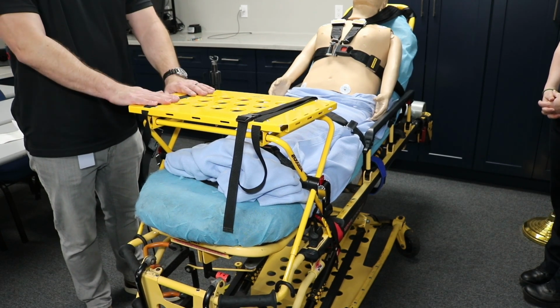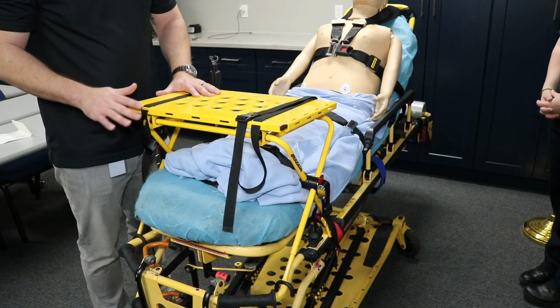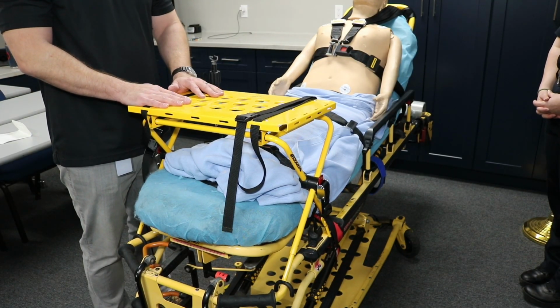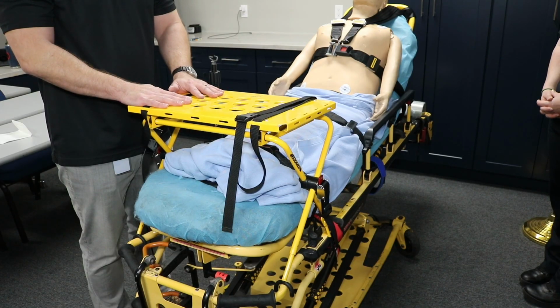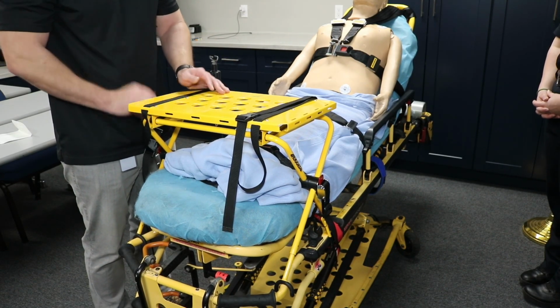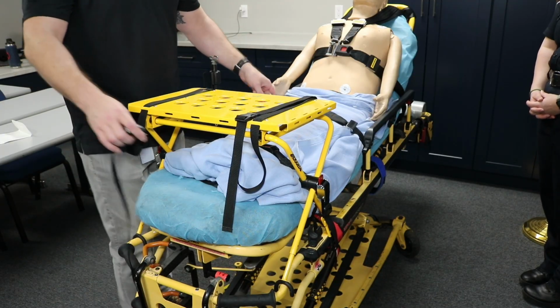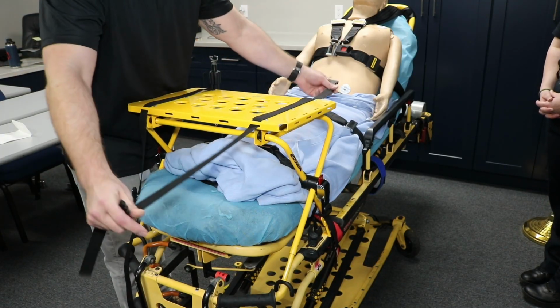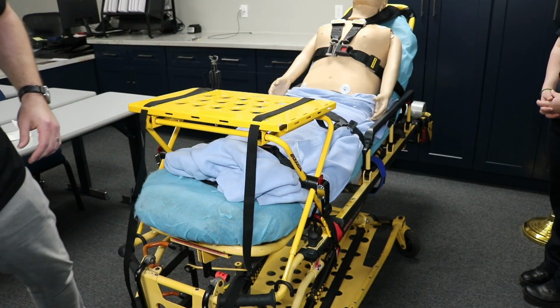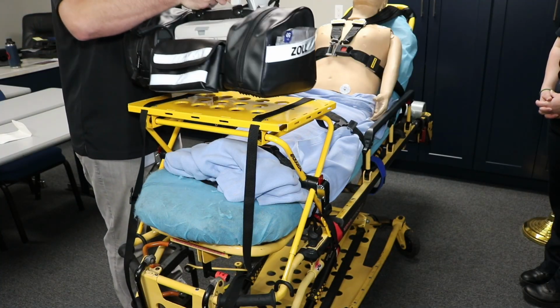Perfect. Next, we're going to come in with the monitor. The tray can be used with the monitor, it can be used with the pumps, it can be used with the ventilator, it can be used with the Airvo as well. So multiple different pieces of equipment we can attach to this. Make sure that we always use hard points of contact on our monitor or our pump, whatever we are hooking to it.